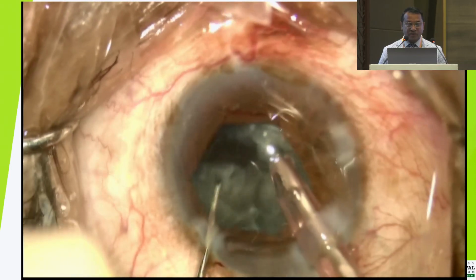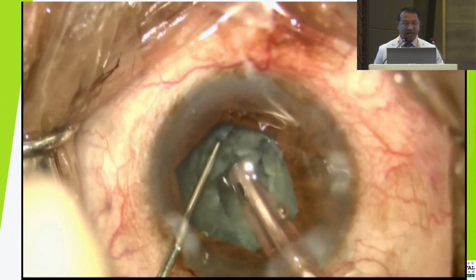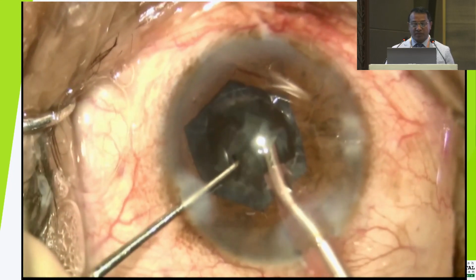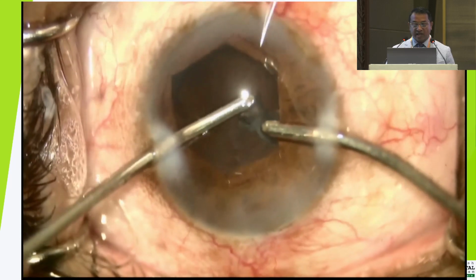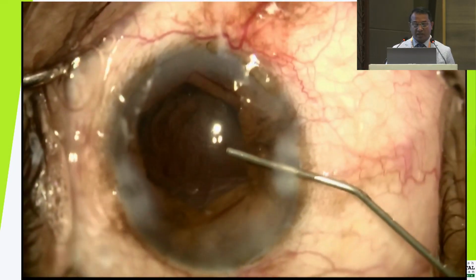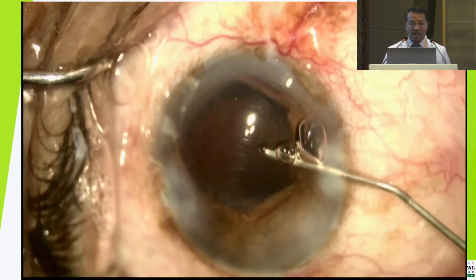Here I am using the Stop and chop technique to divide the nucleus into multiple fragments, and here also I am keeping my bottle height very low. Phacoemulsification is complete with the routine torsional ultrasound and interrupted burst modes. I'm using the bimanual I/A, and before taking out the handpiece, I'm injecting the cohesive OVD, because my next plan is to implant the IOL.